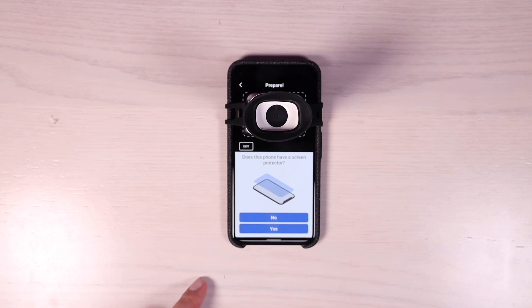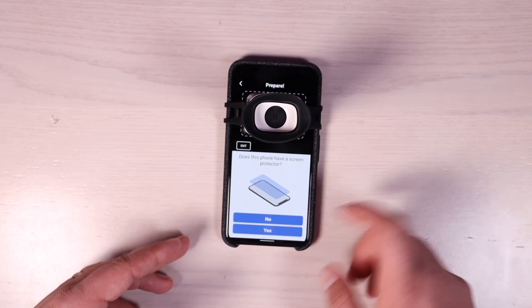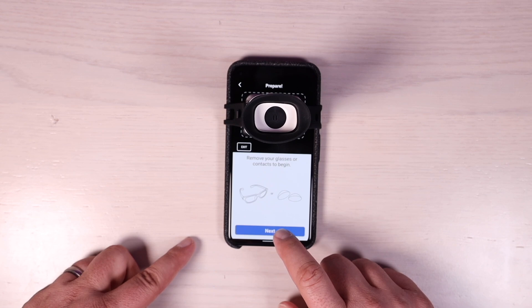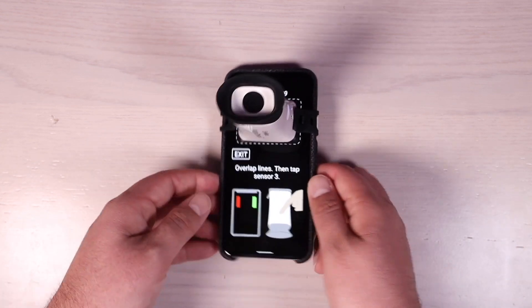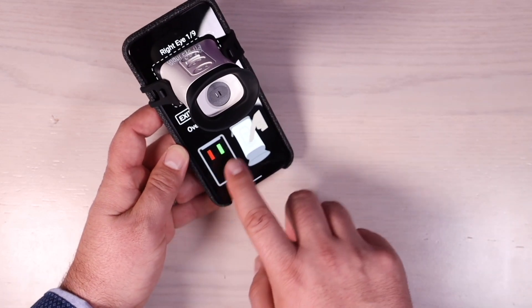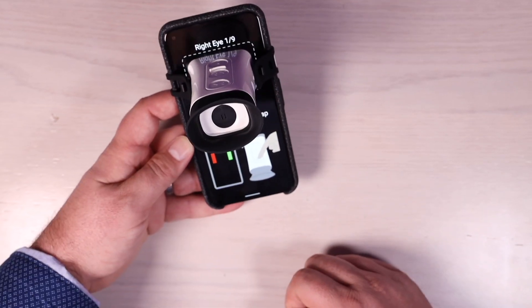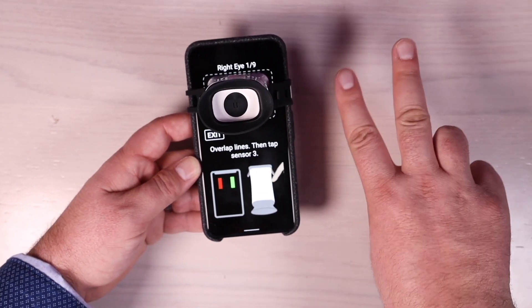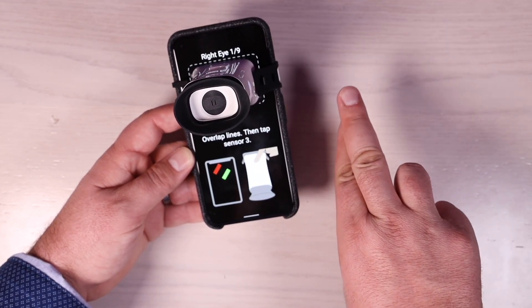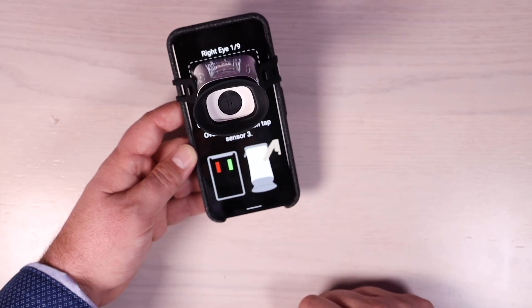Once you have this attached, hit next. It wants to know if your phone has a screen protector — in this case it does not. It says remove your glasses or contacts to begin. What you're doing here is using these two buttons to overlap the lines. When you look in you're going to see a red and a green line — they won't be touching each other. Use the two buttons to move them together until they overlap and make a yellow color.